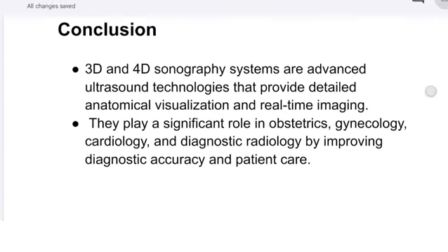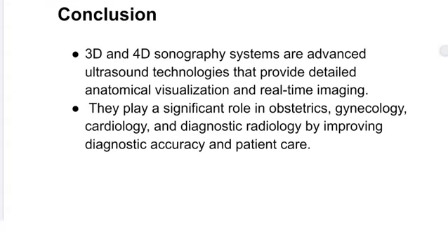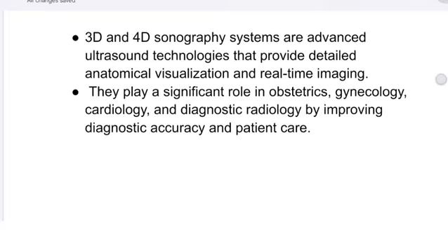From this we can conclude that 3D and 4D sonography systems are advanced ultrasound technologies that provide detailed anatomical visualization and real-time imaging. They play a significant role in obstetrics, gynecology, cardiology, and diagnostic radiology by improving diagnostic accuracy and patient care. So that's all for today's topic.